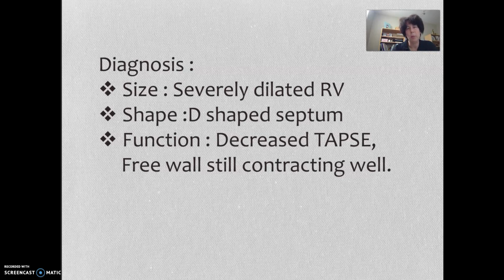And these are probably pieces of information that I think you can agree will be very helpful to an anesthesiologist going in doing a potentially quite demanding case for the patient's cardiorespiratory system, doing jet ventilation with potential hypoxia, CO2 retention, and clearly requiring some kind of hemodynamic support to tolerate those respiratory variations.